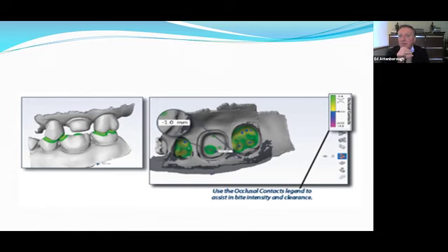always cause a certain uncertainty, and as a rule of thumb, with the buccal bite scan, the more data you can capture, the better. Really take your time. Most people whiz around in 15 seconds, but the more points you've got, the more accurate the occlusion is going to be. And for a full digital restoration that's produced without a model, that's going to save you a lot of time potentially adjusting the occlusion chairside once you receive the restoration.